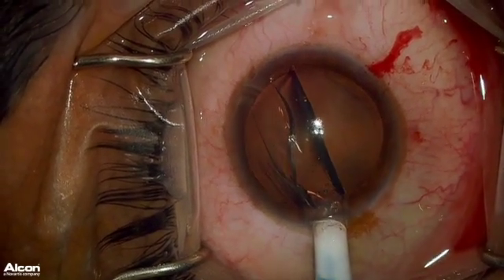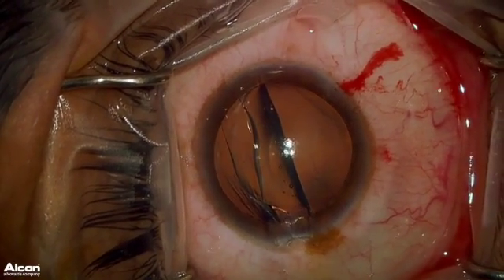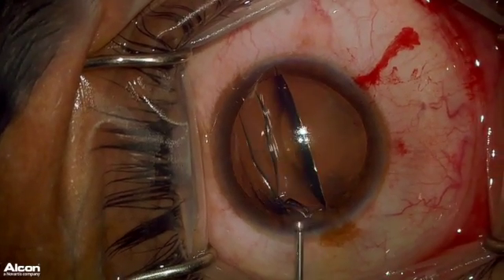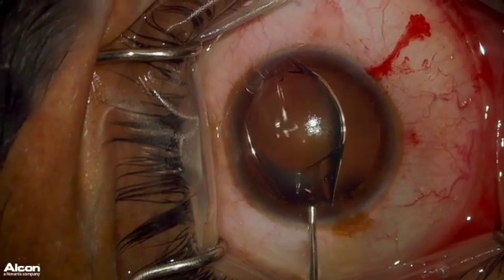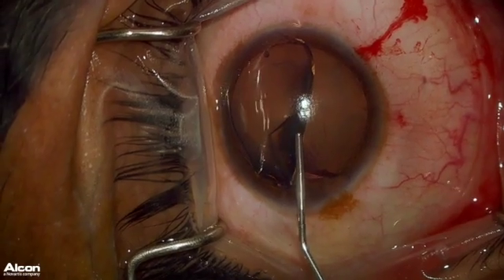At this moment, you have a few seconds where you can try to flip the ICL to the correct orientation while it is still folded on itself, by orienting your OcciCote cannula into the fold and using OcciCote to try to get the folded footplate back to the correct orientation. But as you can see, this did not work, and now the ICL is completely flipped upside down.